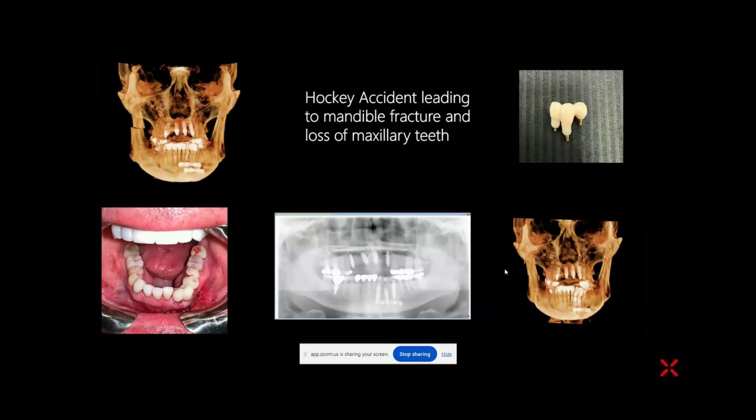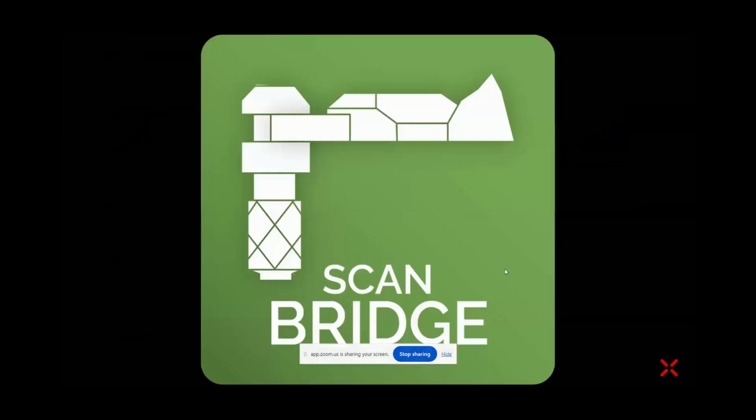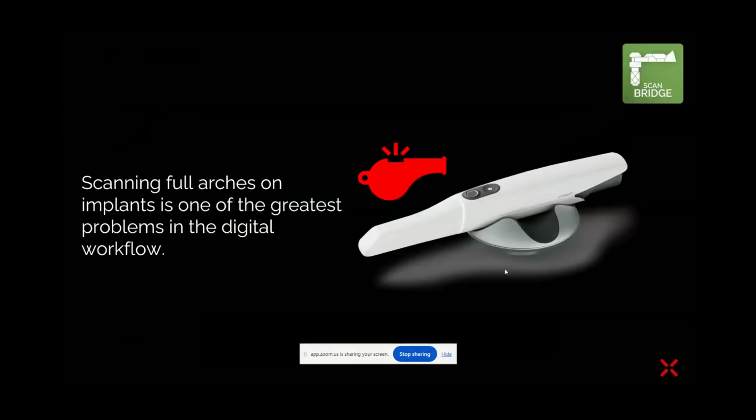We could have just done a bridge there, but after discussing the case with Dr. Dunlop, we decided to go with the 3 implants just in case we lost one, because those screws in the bone were quite deep, and we thought there might be a chance we could lose an implant. So once again, we got a fantastic result utilizing the TRI implants, and of course the ScanBridge in the maxilla, but in the mandible we did the photogrammetry.